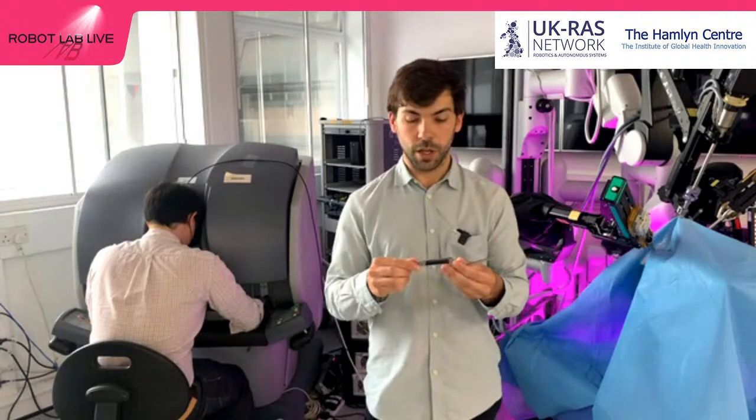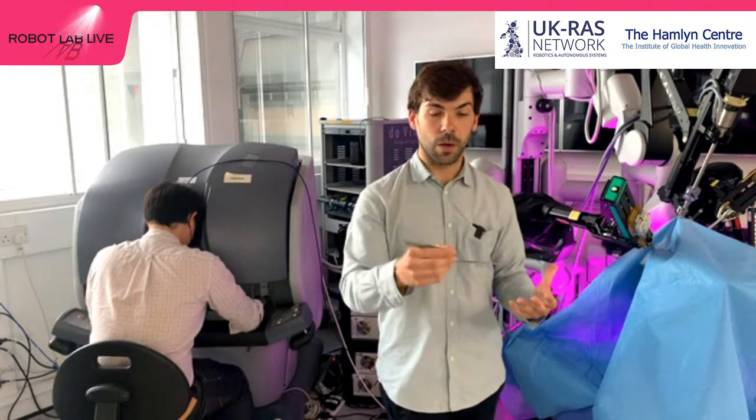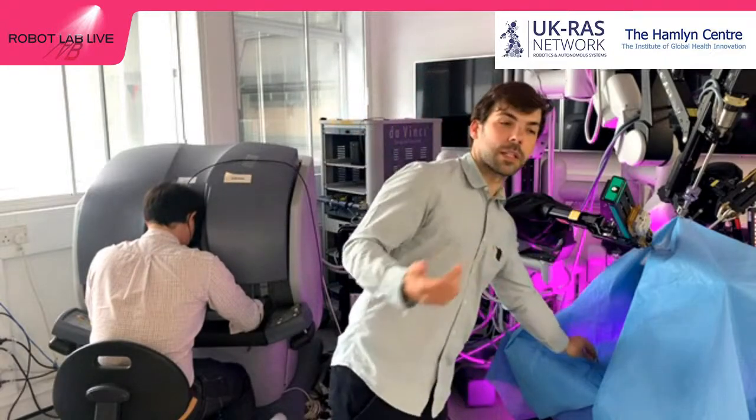For instance, we could have a system that magnifies the perception of force. With your bare hand, you can feel when you try to take something, right? But when it's very, very small, you might not feel it. So we can have a mechatronic system that magnifies and enhances the capabilities of our hands, and allows us to feel something that before we couldn't. So it's pretty cool. But let's go to the robot that we will be showcasing today.